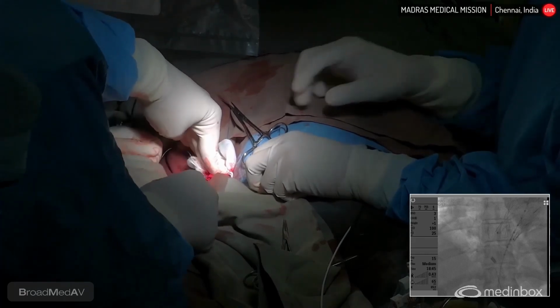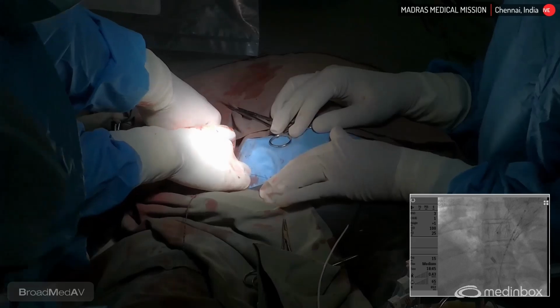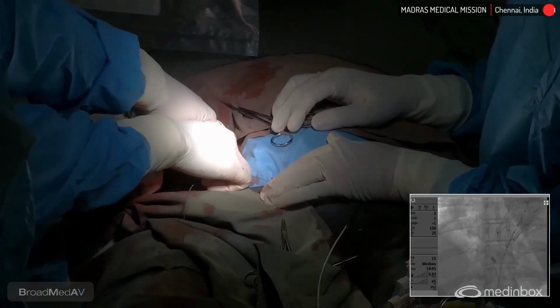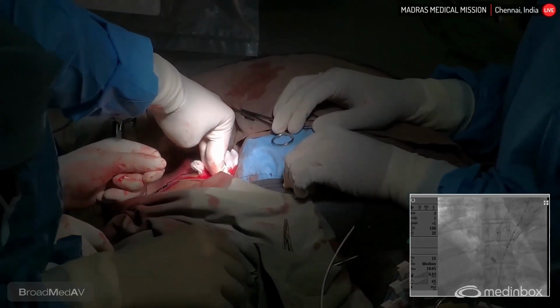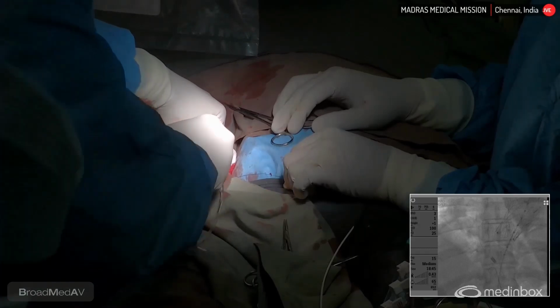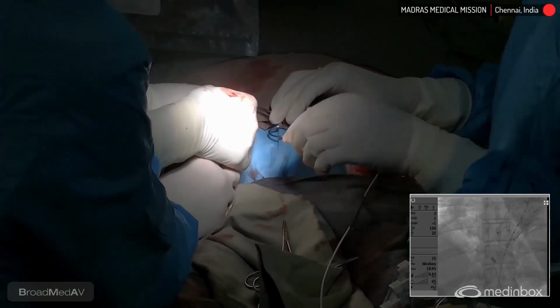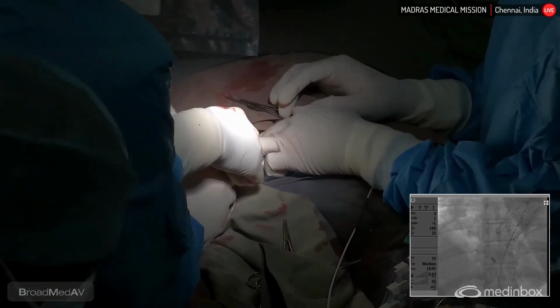You wait 1 second. You take care of this one. Yeah, I will hold this. Remove your hand, you put 7 French. So now we are downsizing to 7 French. Now that will be last. I think usually it will get controlled.